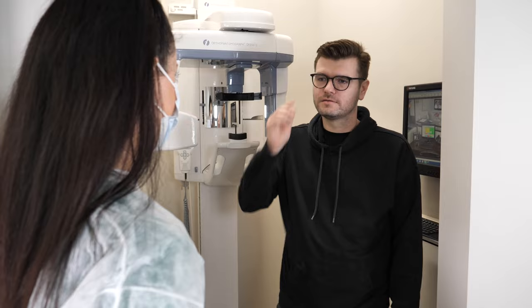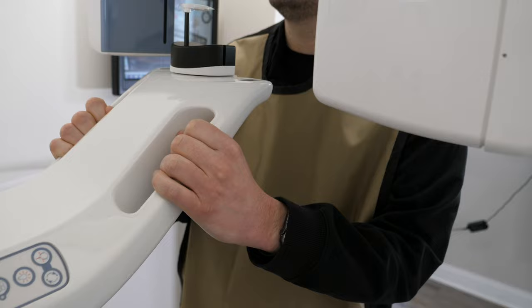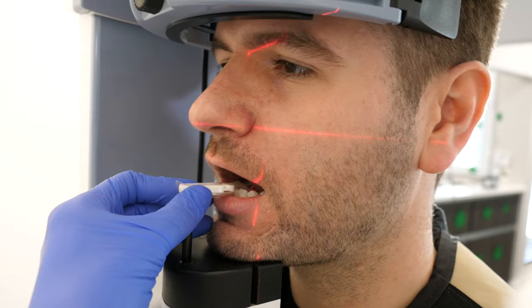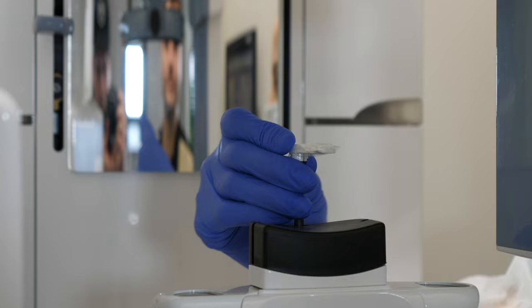Next, the dental provider may place a lead apron on you and have you walk into the panoramic machine. Oftentimes, they will have you hold the sides of it with your hands and will also let you know where you should put your feet. The dental provider will fix the height of the machine according to your height so you can comfortably bite down on the little stick. They will explain to you where you want your teeth according to the type of stick that they have for you to bite on.